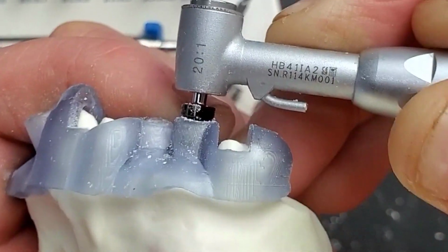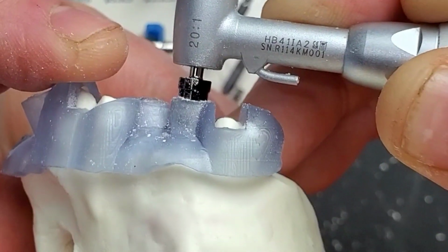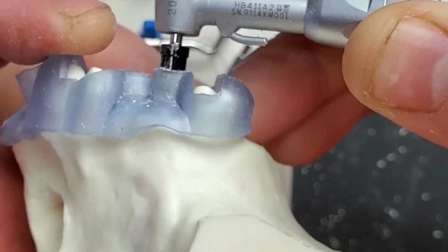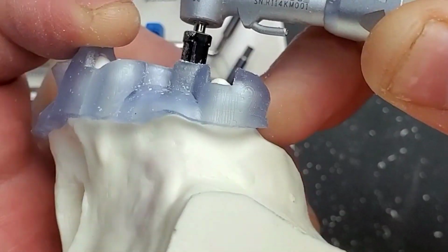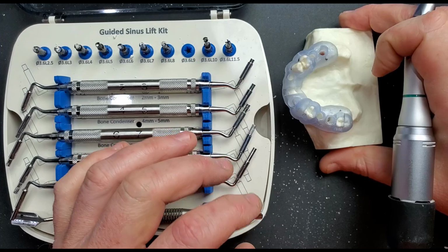and I've not risked putting any excessive pressure on the membrane. The most pressure that we can put on the membrane is about 1mm of vertical height. That's generally not enough to damage the membrane, and it should keep that intact. So I don't even run that drill. I can just take this one out, and now we can begin the lift.